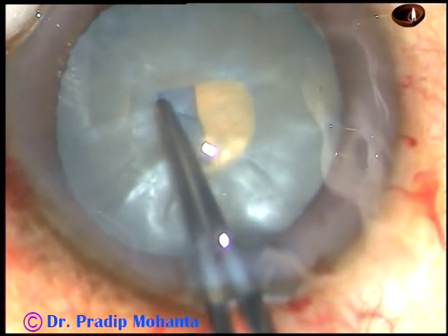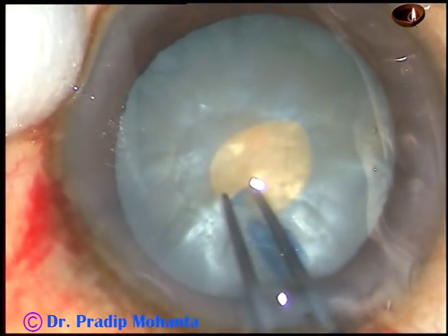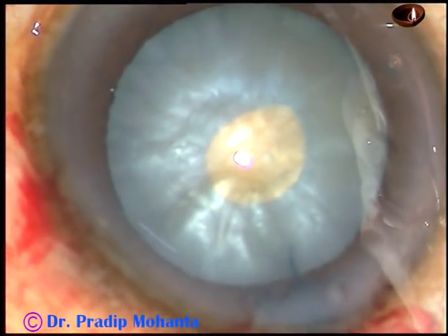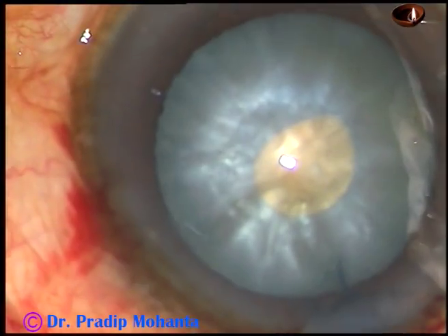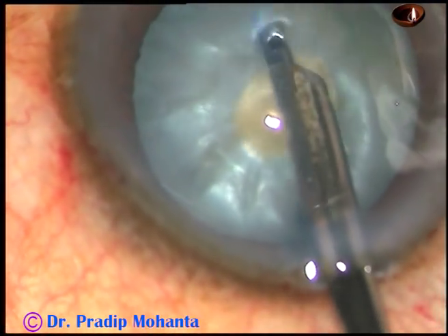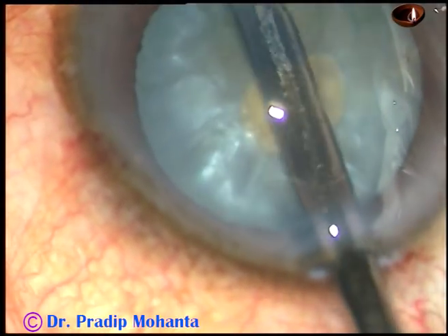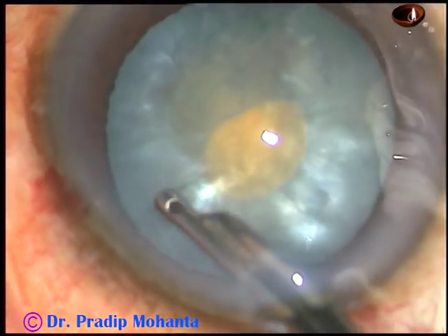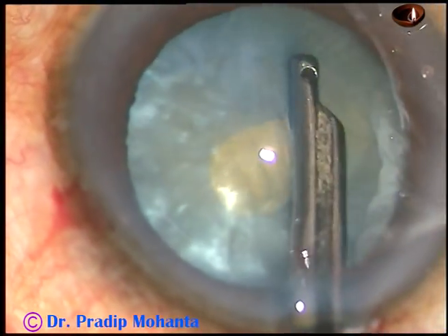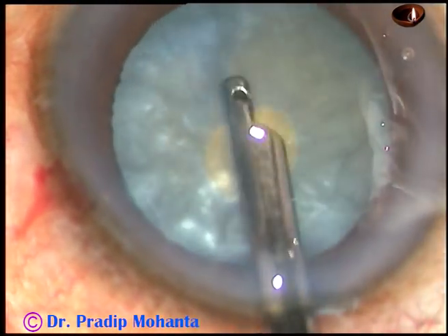Now I convert this small C-flap into a small rhexis — I call it a mini rhexis. Now aspirate some lens matter through this small opening and decrease the intralenticular pressure, and the character of this cataract will change totally. It will be just any other cataract.